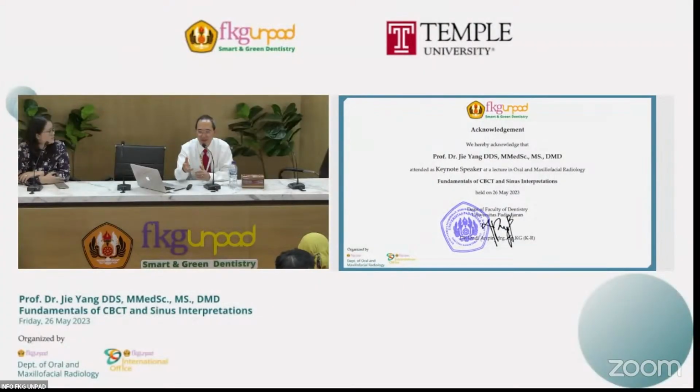If anything is related to the bone, if there's a bony lesion, you probably can use cone beam CT. Even for a mucosal lesion, if it's adjacent to the bone, like oral cancer, squamous cell carcinoma adjacent to the bony structure causing erosion, certainly we can use the cone beam to see. TMJ we can see, and this morning I was talking in the Congress there.